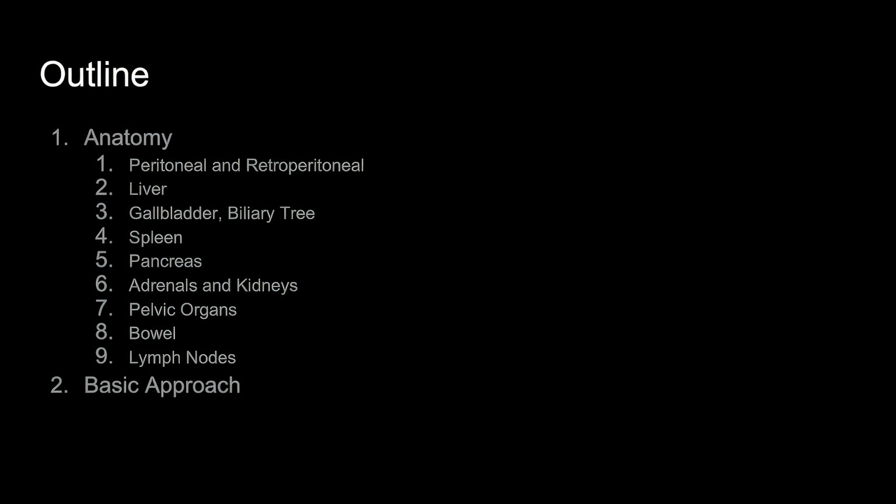Before we jump into a normal scan and go through basic anatomy, I think it's really important to understand a few basic things about the peritoneal cavity. I start with this because when people are first starting out, they often have a difficult time conceptualizing peritoneal anatomy, and the basics of peritoneal anatomy are frequently clinically important. So I do think it's a good place to start before jumping into scrolling through a CT.